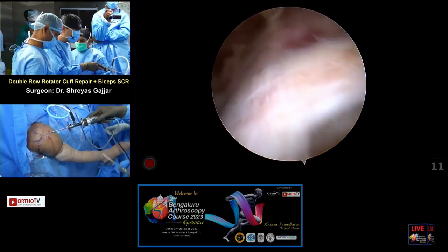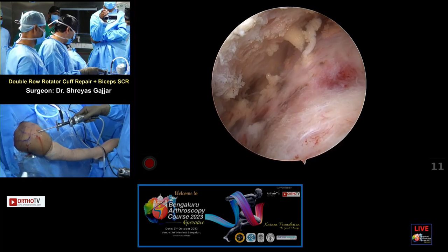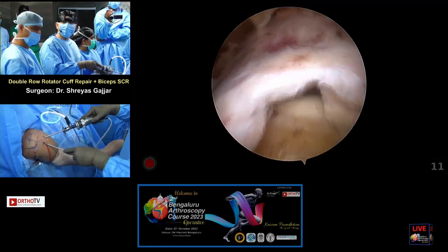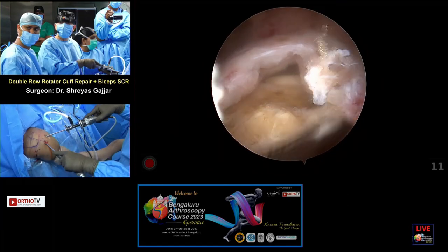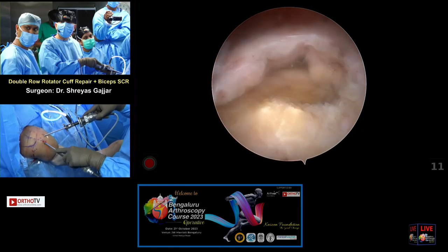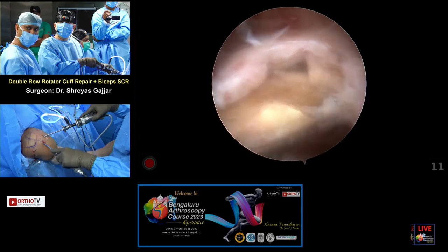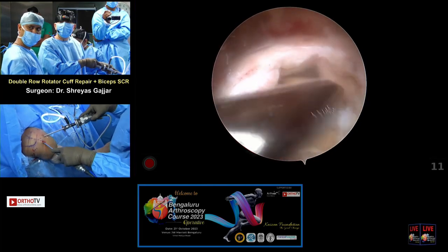A good way to ensure that you don't take away too much bone while preparing the tuberosity is to use the burr in the reverse mode, not the forward mode. Can we clean this, please? Yeah, that's it. And just keep moving, don't stay still, otherwise it will dig into the bone. Ensure that you have taken this soft tissue away, and that's more than enough, because the anchors are vented, so you will have a good bleeding from there. So I'm using the burr in reverse mode on the foot pedal, just to prepare the tuberosity footprint. So that's enough.